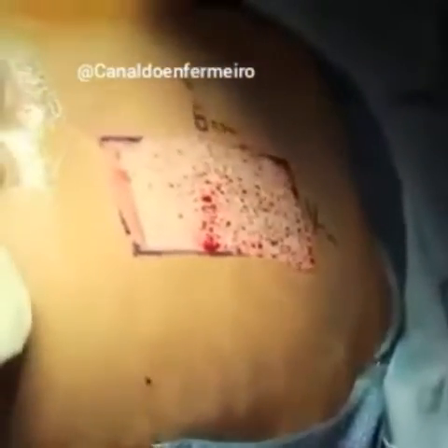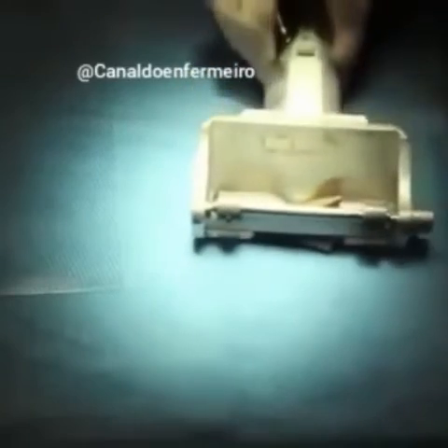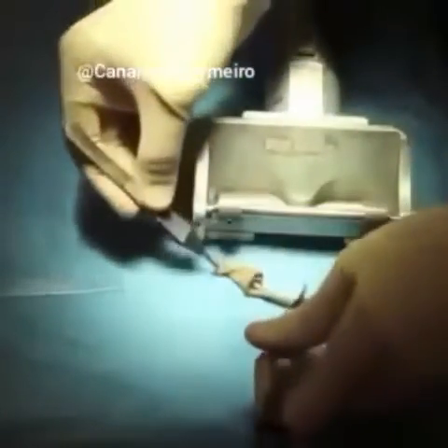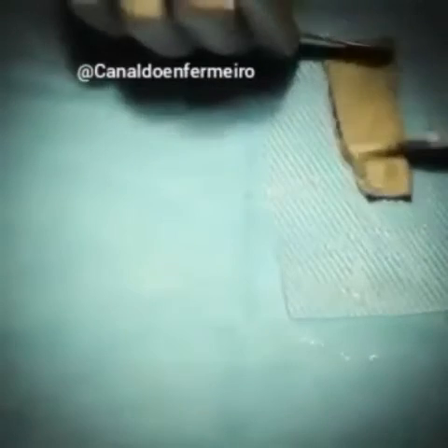The donor site, as you can see, is then covered briefly with a towel while we prepare the skin graft. The dermatome is then released and the skin graft is pulled out carefully. You'll notice as the skin graft contracts — that's called primary contraction.